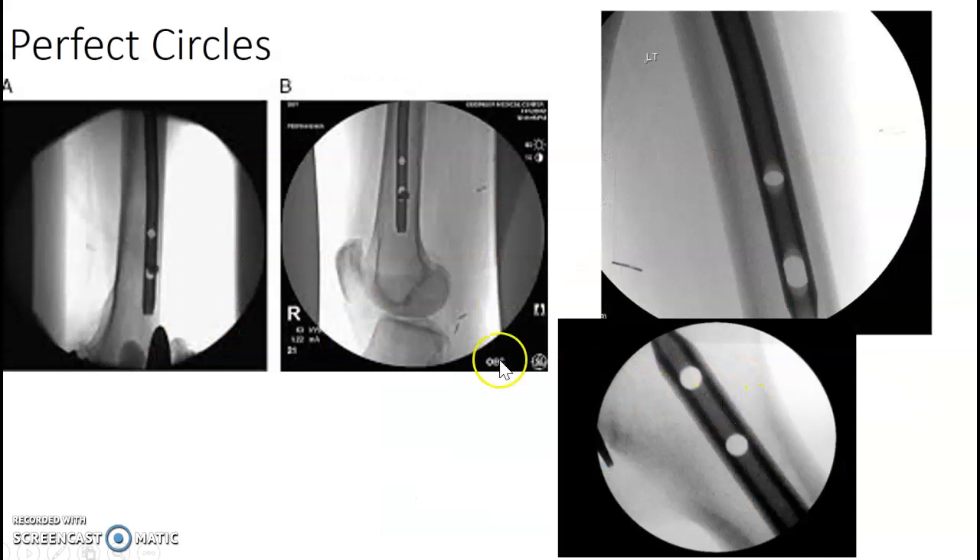Perfect circles. Your surgeon may ask you to find perfect circles. Down here are perfect circles — you can see clearly up here these are oblong, more like watermelons or lemons if you don't have it right. They have to put screws straight through these holes, which is why they want perfect circles. You're going to have to use some angles of your C-arm to get those on point.